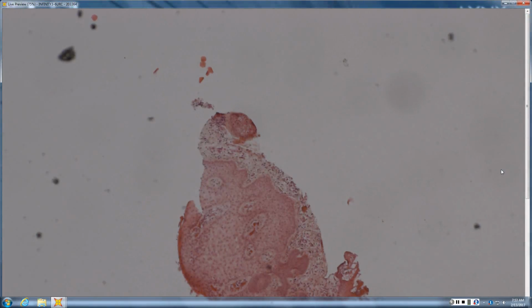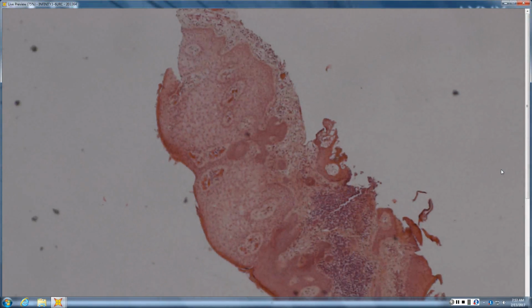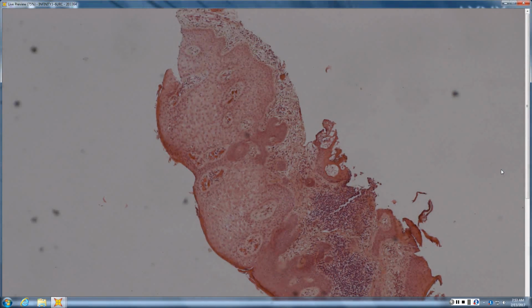So you have a little shape here, a glycogenated area there. That makes me think of sort of a trichilemmoma. So trichilemmoma hangs off of the epidermis. Is this hanging off of the epidermis, or is it the epidermis that's glycogenated? It is the epidermis, the whole epidermis. It's not something hanging off the epidermis.